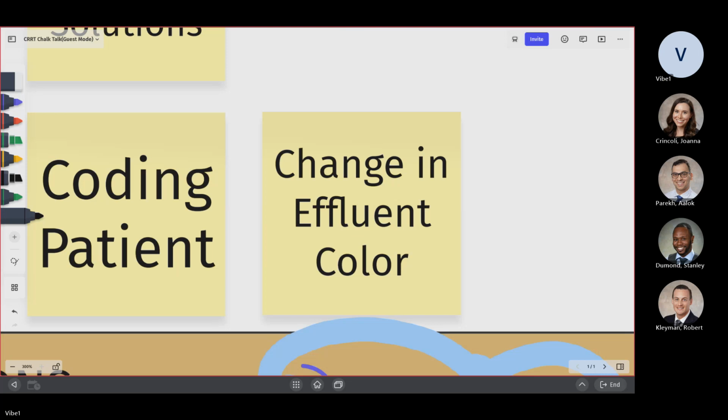In the past, that cartridge used to be sent to the manufacturer for analysis, but nowadays they don't do it because it's a biohazard, since it has blood in it. So now they take the lot number and send it to the company just to make sure there are no other issues with a similar lot. But anytime there is any blood leak, it has to be immediately stopped and you have to put in a new filter.